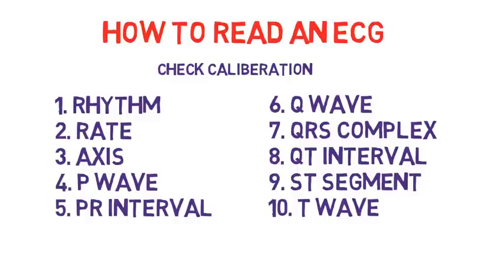So this is all about ECG. Always think of these 10 steps in this manner and you will be able to detect majority of arrhythmias very easily.